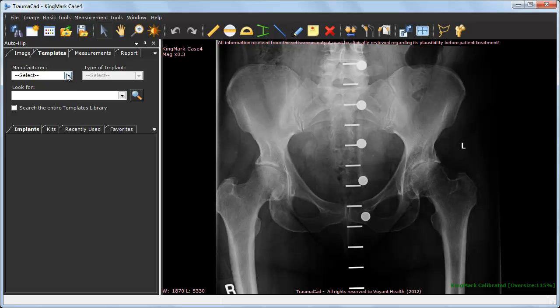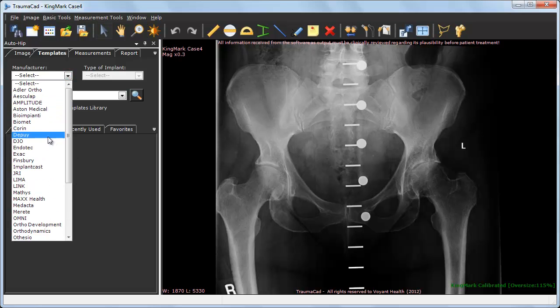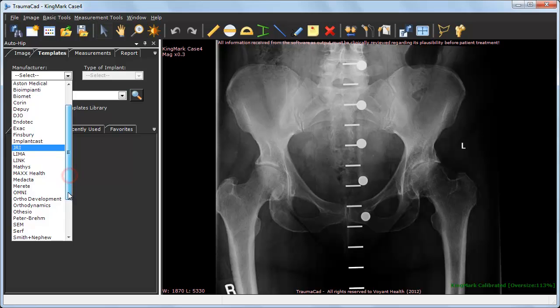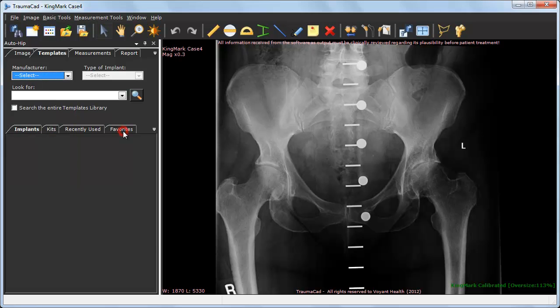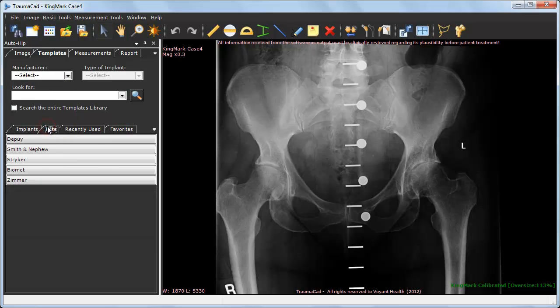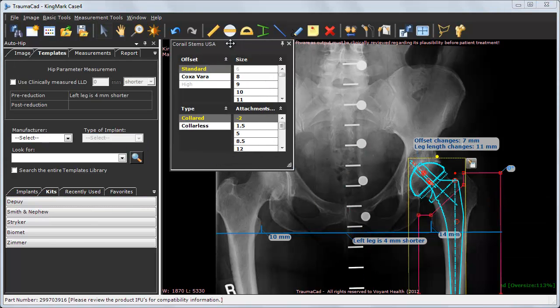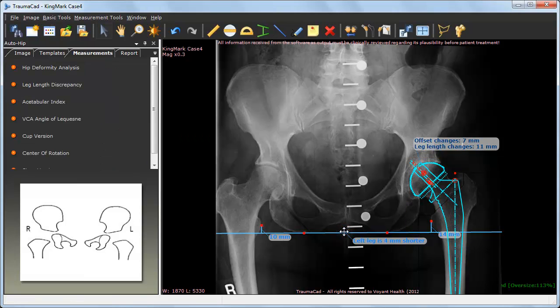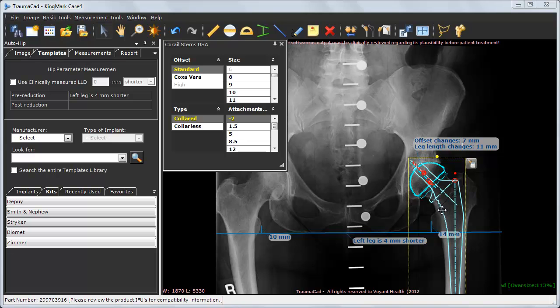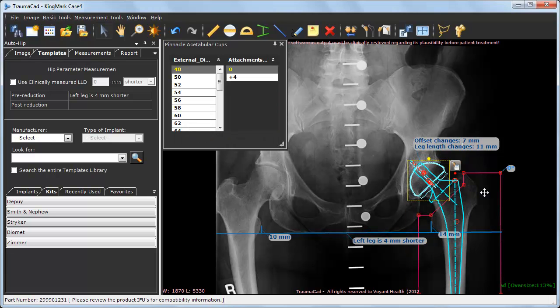In order to apply an implant to the image, you can easily select a template from a list of implant manufacturers, or select from your own predefined favorites or kit lists. With one click, the application automatically detects the anatomic origins in the image, positions a leg-length discrepancy measurement tool, positions the selected stem in the femoral canal and the cup in the area of the acetabulum, and a fragment is created according to the suggested femoral head osteotomy line.